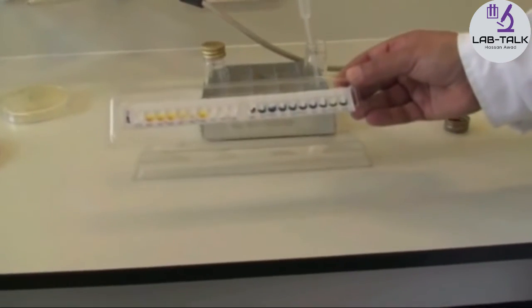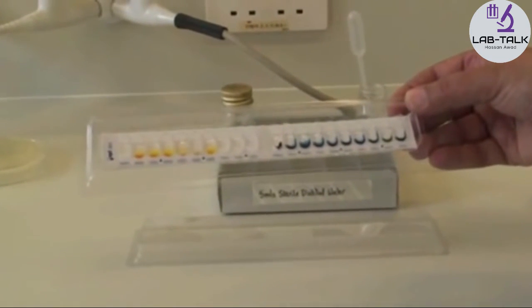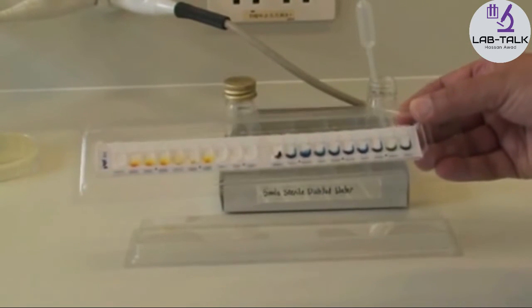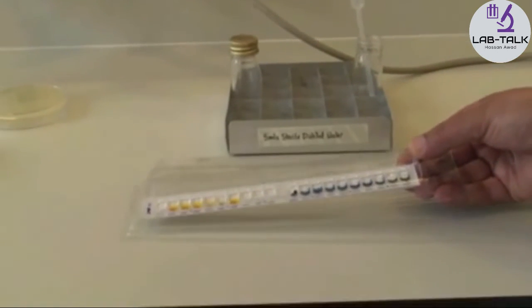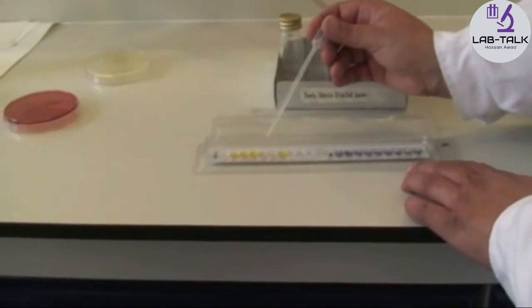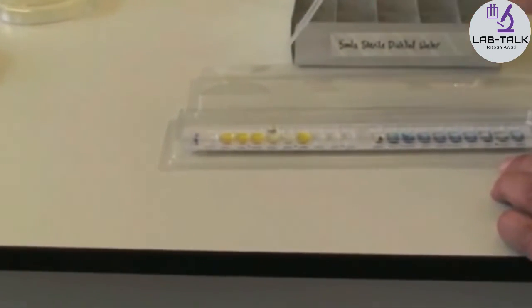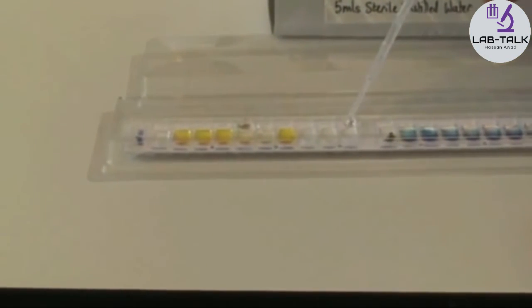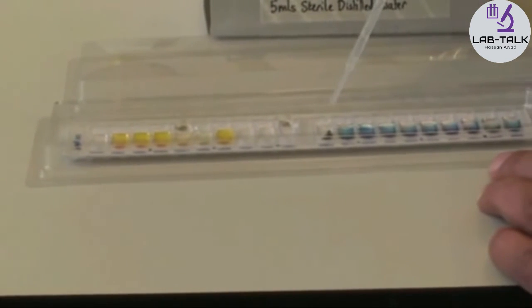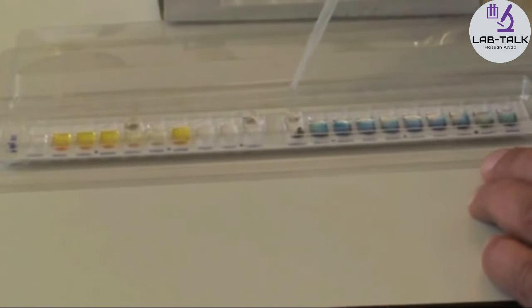Pick it up and check for any air bubbles. There aren't any, so put it back down flat on the bench. Top up the citrate cupule with more bacterial suspension, then top up VP with more bacterial suspension, then top up gelatin with more bacterial suspension.